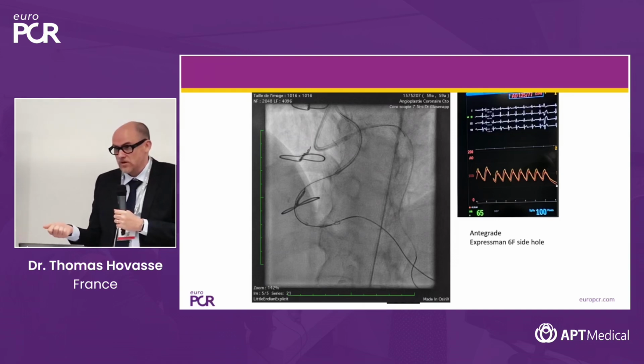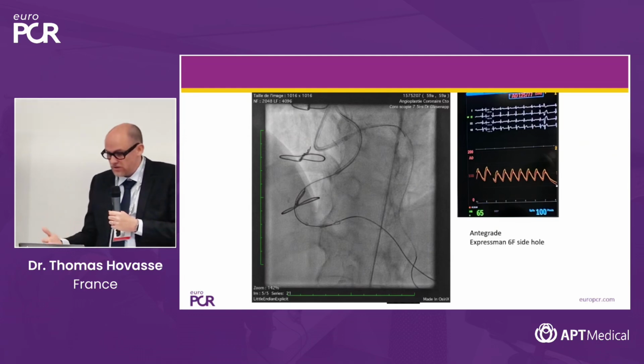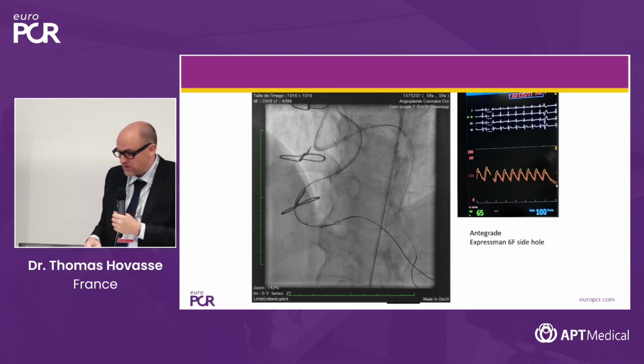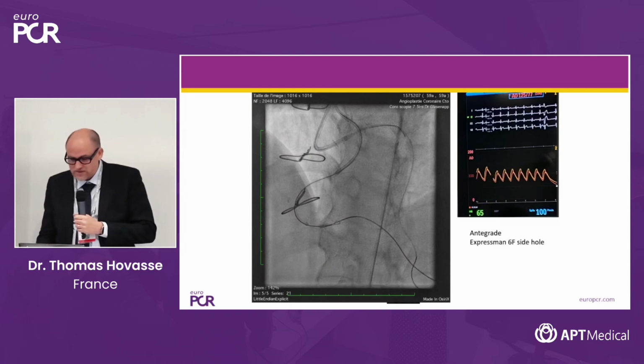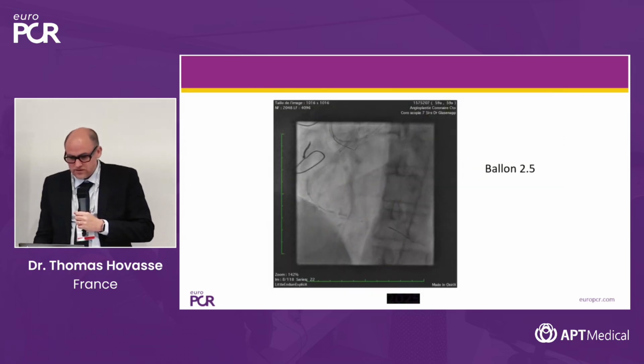So it's very comfortable because you don't have EKG modification, dampened pressure, or fear of injection. And you see here the Expressman is at the level of the distal right, and still the pressure is normal. So this is the reverse cart and then predilatation.